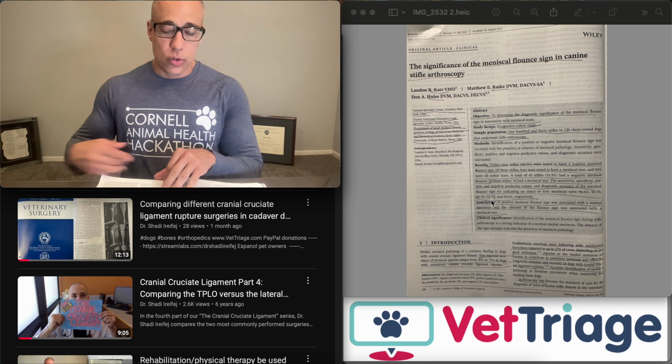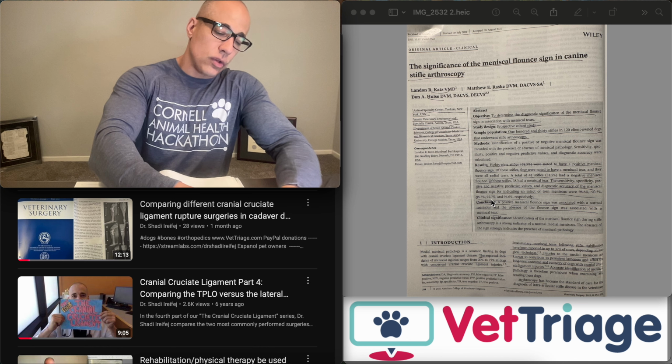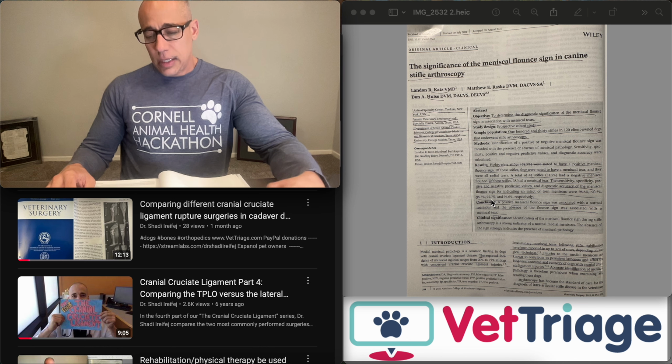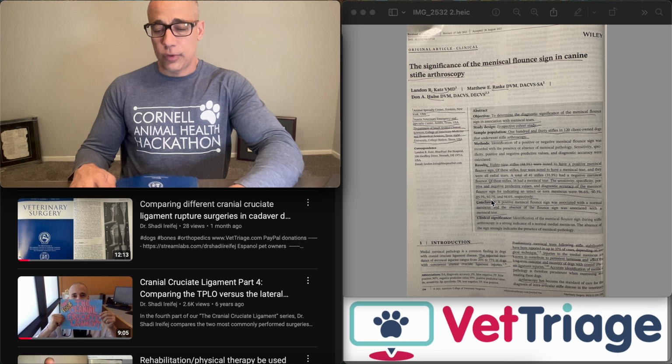But this is pretty cool. I haven't heard about this before. I think it's great. And especially for those stifles that are really arthritic, have a lot of periarticular scarring, they're just causing you issues. That's great to have at least a diagnostic, a fairly easy sign to look for this problem.